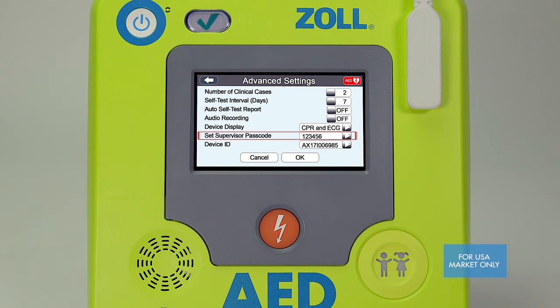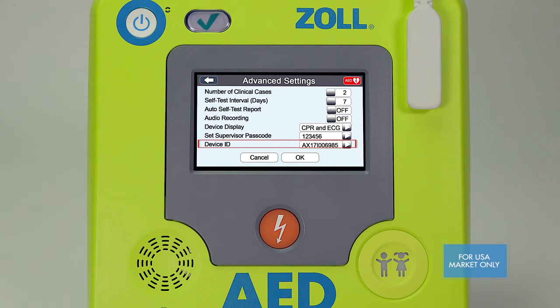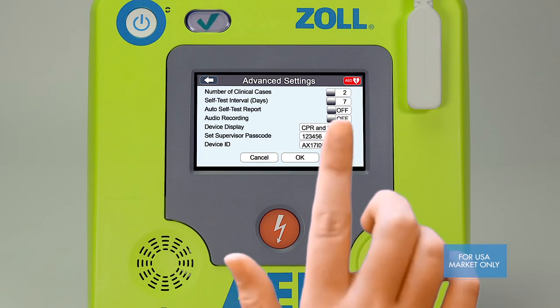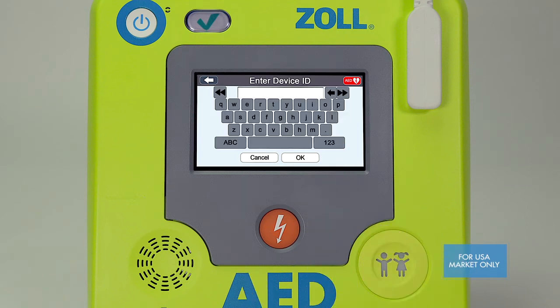You can change your passcode by selecting advanced settings from the bottom left of the screen and then setting up your new supervisor passcode. Make certain you write down your new passcode before you save and exit the advanced features area. The device ID is the serial number of the AED by default, but you can change this — for example, you may wish to identify the AED by the address of a building or its location. Simply touch the device ID box, type in your preferred ID, and select OK to return to the previous screen.